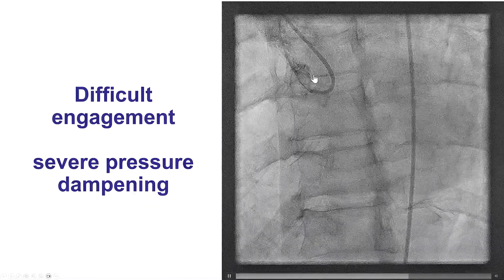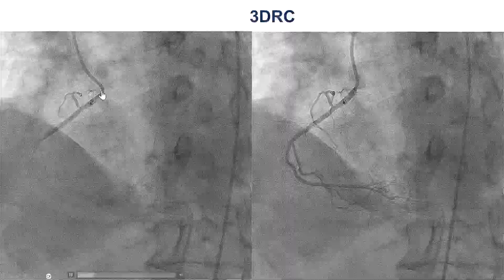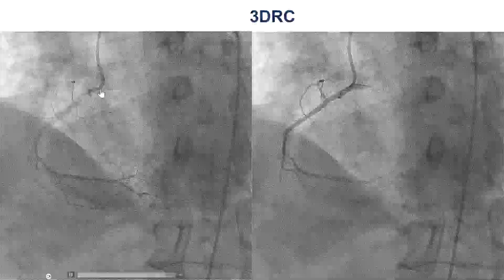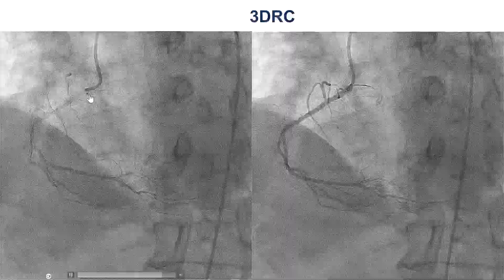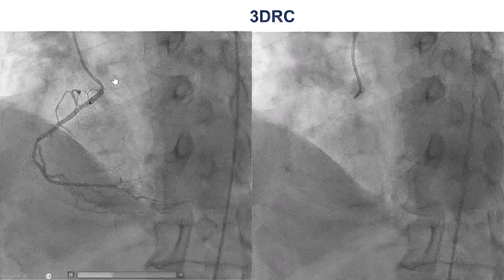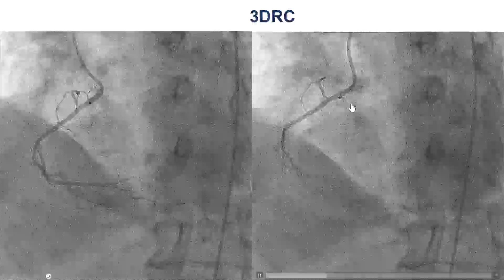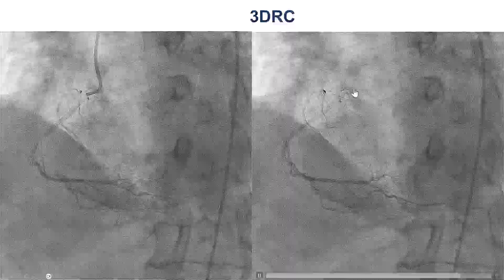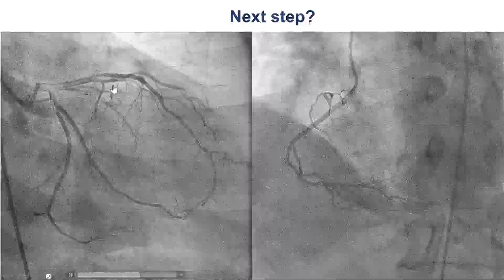Whenever we could engage, we would get severe pressure dampening. Eventually, after switching to a 3DRC, we were able to engage the vessel and obtain an image. What we see is a significant osteal stenosis — we barely see any backflow of contrast coming into the aorta. That was a very gentle injection, and then we pull the catheter at the end. So, very tight osteal right coronary artery along with the Ramus, and these seem to be the culprit lesions.